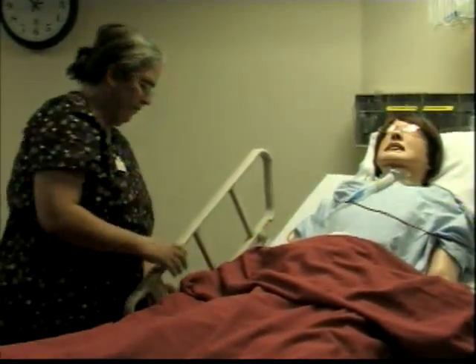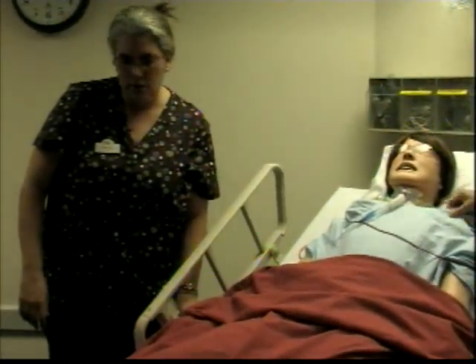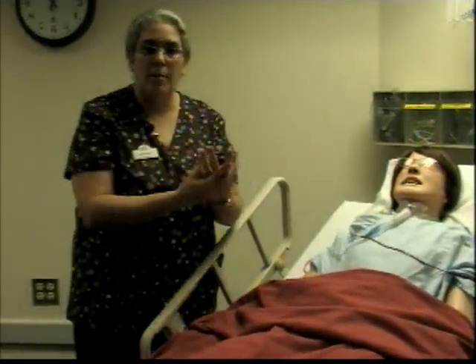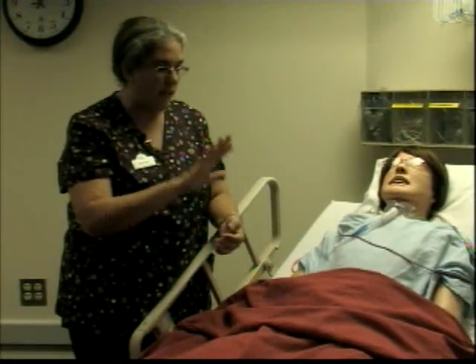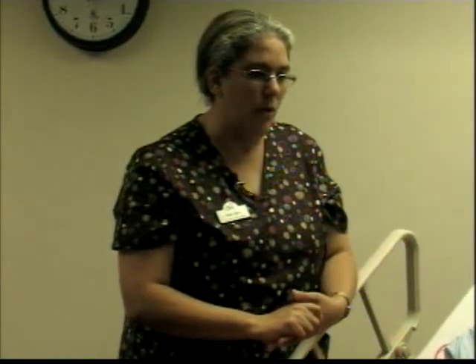Wash your hands and tell the client what to expect: you're going to feel a little bit of pressure and the need to void, but the catheter is collecting the drainage directly from the bladder. The pressure they feel is because the balloon is sitting right at the opening of the sphincter. Tell them to relax their pelvic muscles so the bladder can empty. Pain, burning, or significant discomfort are not expected — those are signs to report to you for further assessment.